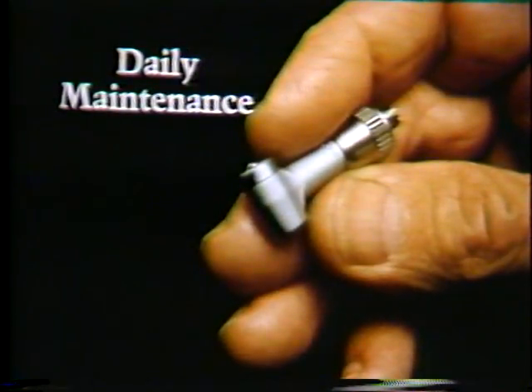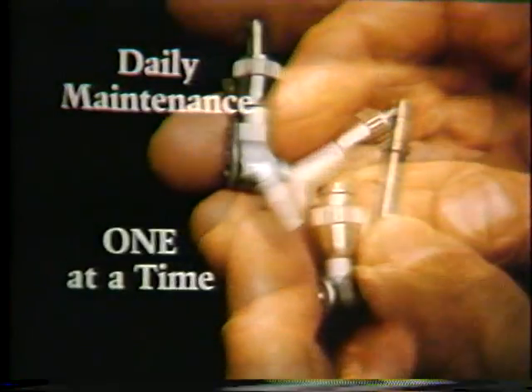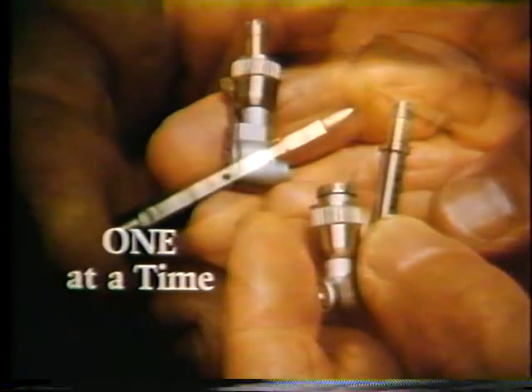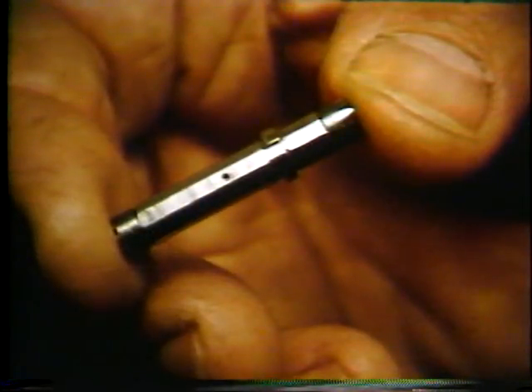The daily maintenance of the friction grip angle is the same as the latch type. However, it is a good idea not to clean both contra angles at the same time, since you might accidentally switch the drive shafts. Drive shafts will last longer if they stay with one contra angle than if they are interchanged.